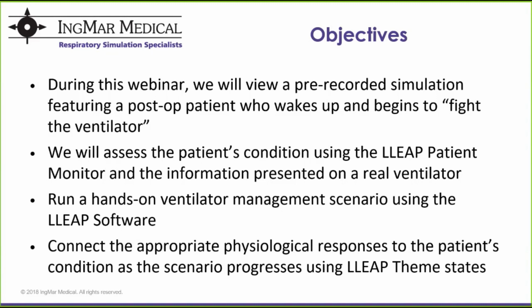We will be provoking changes in our patient's condition using the LLEAP Instructor application. One of the main purposes of today's session is to demonstrate the way in which we can structure scenarios of this kind using LLEAP themes.